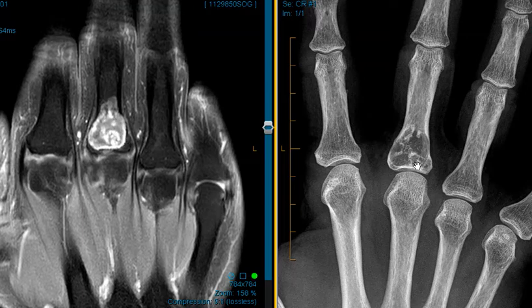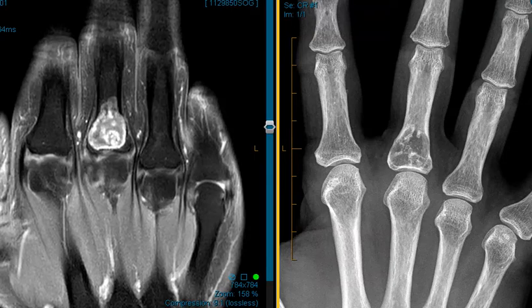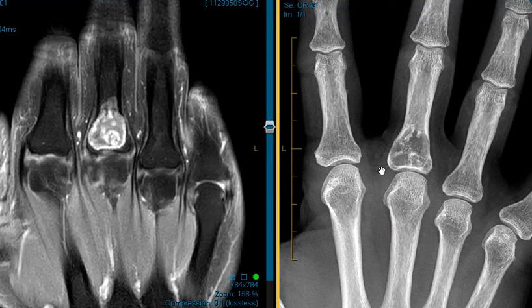This is a classic appearance of what we call an enchondroma of the fingers. It's a nice example of what they look like: a lucent lesion that can be heterogeneous with some speckled calcifications, can be minimally expansile, has sharply defined margins, and can have a little enhancement just like this. If you see a lytic bone lesion that looks non-aggressive in the finger, think about enchondroma in your differential. Thank you very much.